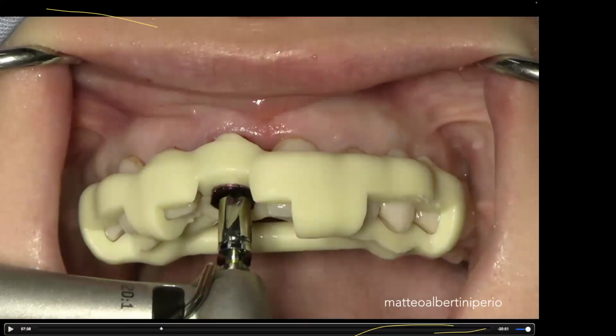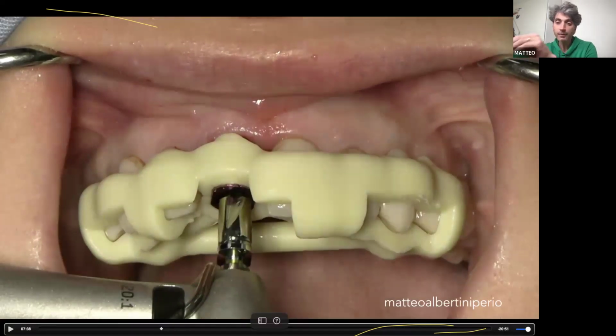Okay, if this doesn't happen, you have to go back and use a shorter drill.